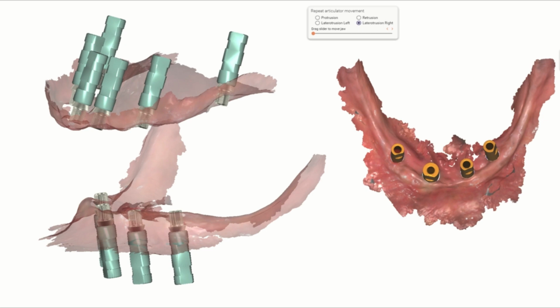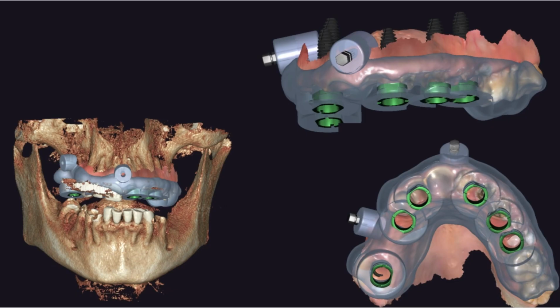Look at the final result. Implants in parallel, implants within the bone, implants respecting your final prosthesis. You can get this in two ways: either by correct planning from the first, or you have to be a magician. Of course, you are not a magician, you are a perfect dentist. So you have to follow the planning key.